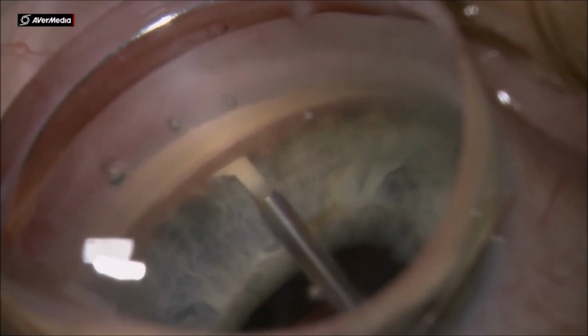And in this second case, I'm able to use the Kahook Dual Blade to do an inside out technique here to take out some trabecular meshwork, making a goniotomy and opening up the outflow, and will have good results post-op.